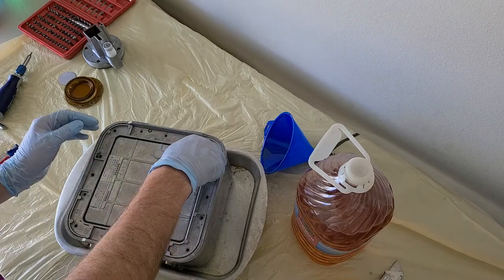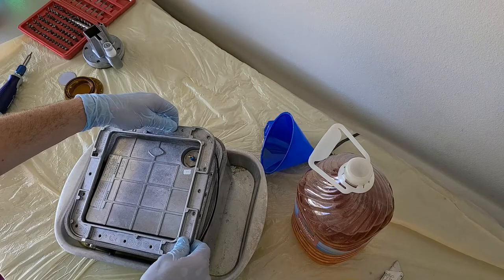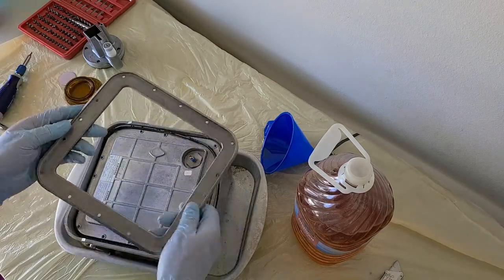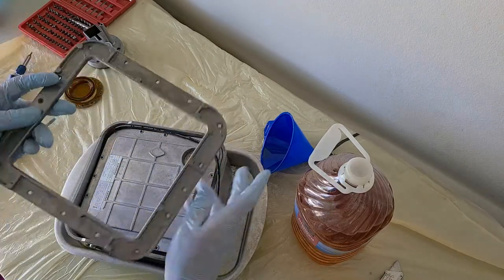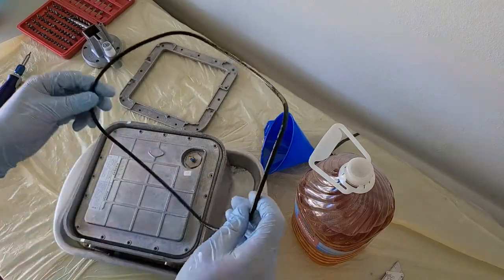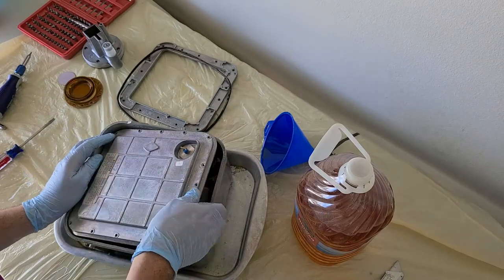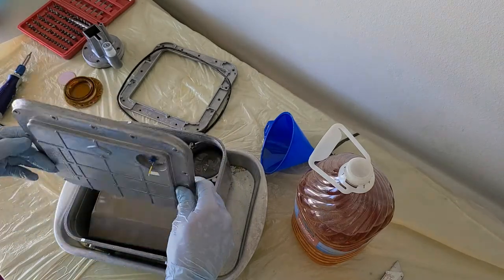Yep. All right, moment of truth. Let's see what's inside here. We have the outer covering plate, a big old O-ring, and the main plate here.